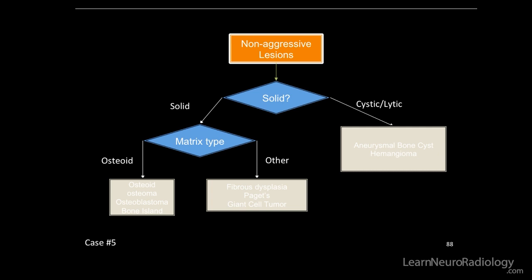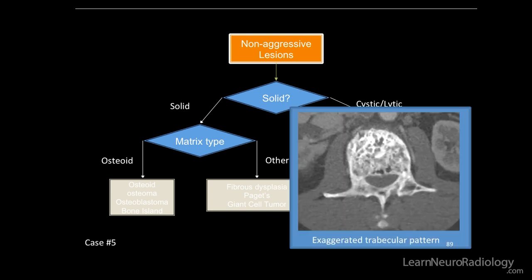Any matrix type to this one? Not really — more of an exaggerated trabecular pattern. It doesn't have a fluffy osteoid matrix or a ring-and-arc type matrix.